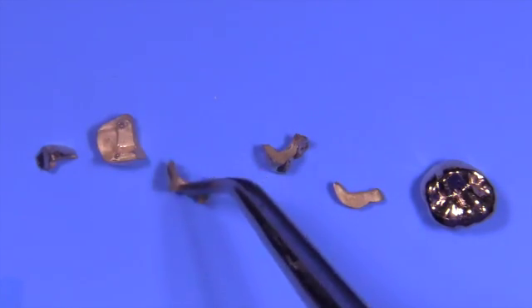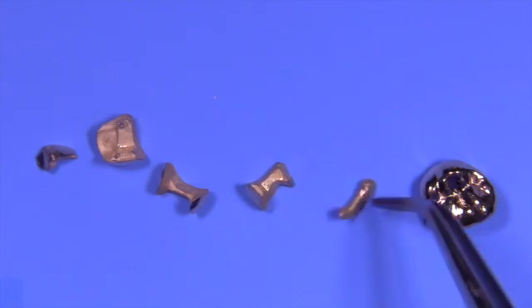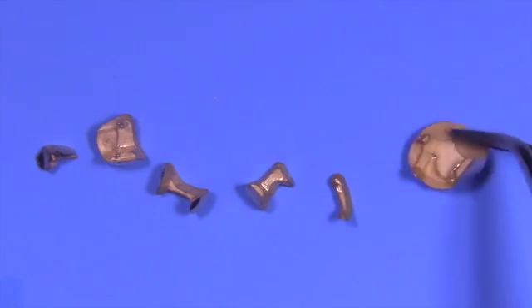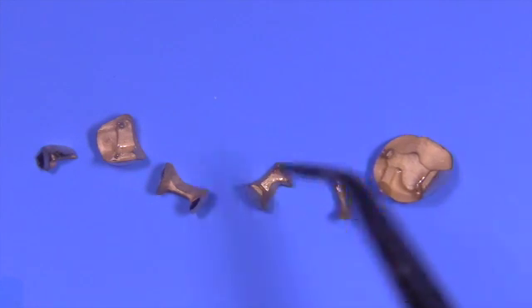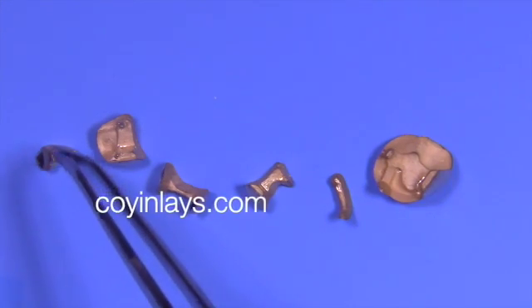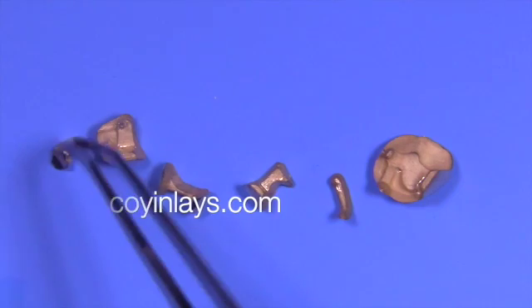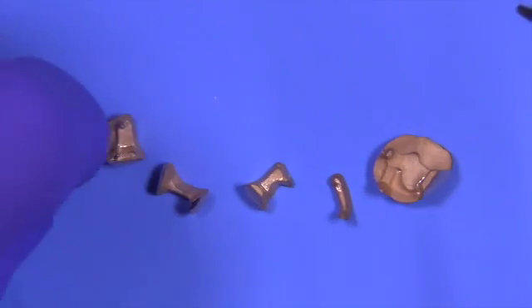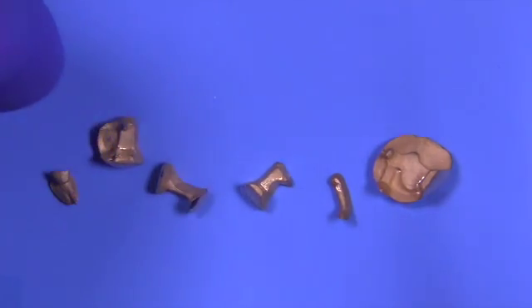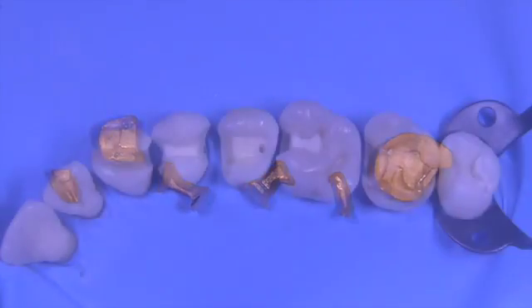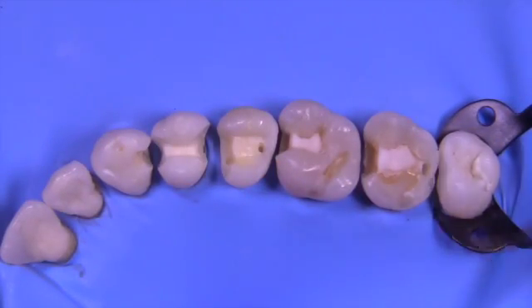Each casting requires a very different water-powder ratio of investment, different temperatures of burnout time, so every casting is invested alone without another casting in the ring with the one that he's working on. This is the level of precision you can expect.